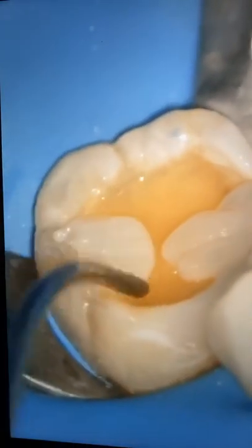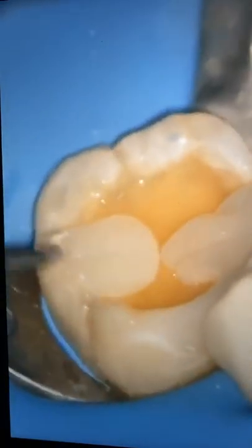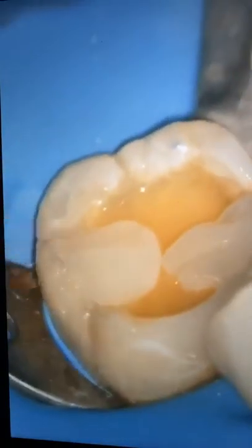Like I already said before, creating posterior carving is just like creating a separation between each cusp, between each composite, and then after you create a separation, you need to make it close to each other, so that you will create very sharp fissures, very sharp separation, and it will create anatomy.